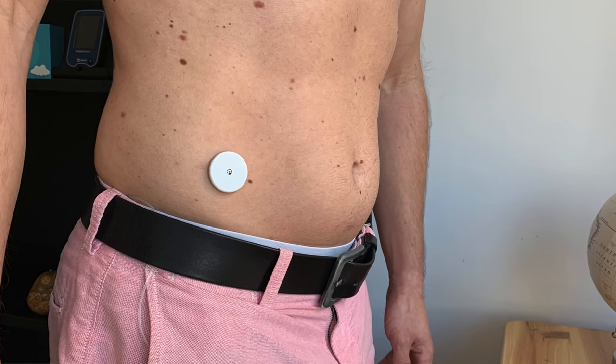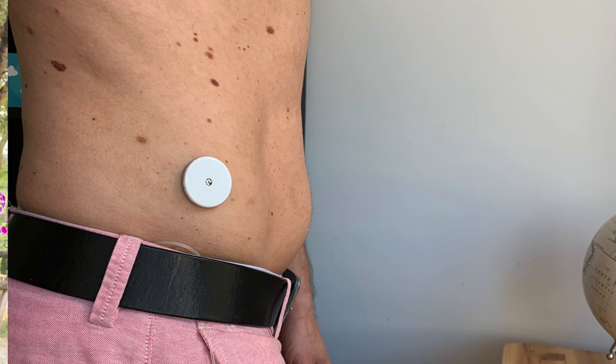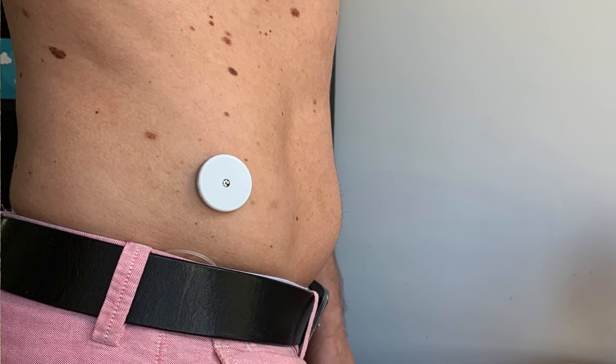My number 4 favorite spot is hips. The main reason why I and some of my viewers like this area is because it's very discreet — you can cover it with your clothes and nobody will see that you have the sensor placed there, and nobody will notice when you're actually scanning. Most of the time this area is covered, so you can really keep your sensor private, taking readings without anyone noticing. It is also very easy to apply the sensor there and it's quite durable because this area is well protected from door frames, which is the number one enemy of all Freestyle Libre users.